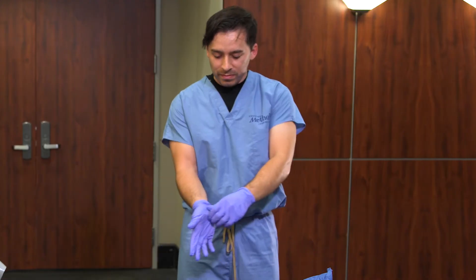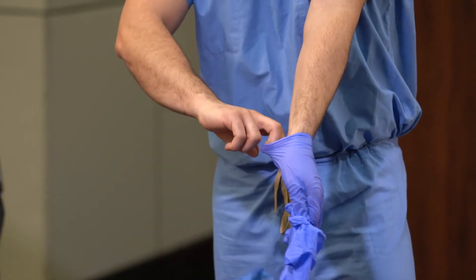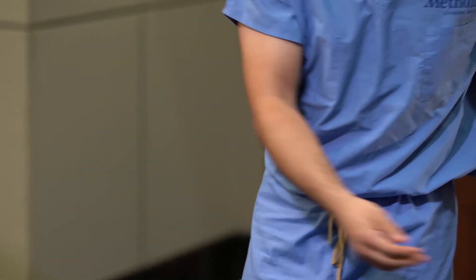Doff gloves using glove-to-glove, skin-to-skin technique. And perform hand hygiene.